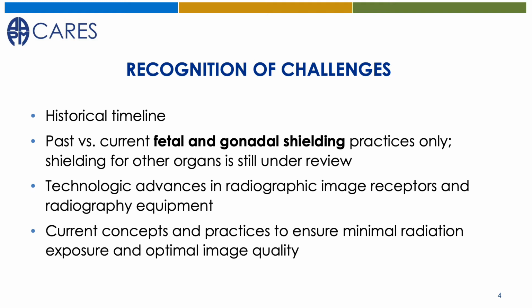Current research suggests the discontinuation of fetal and gonadal shielding, which is a dramatic shift in the practice of radiography, and many professionals may find it hard to implement.